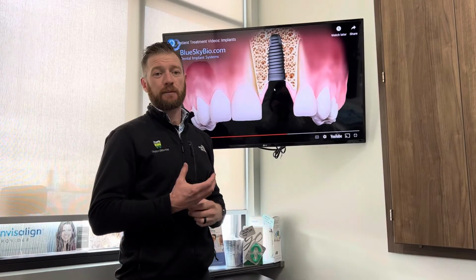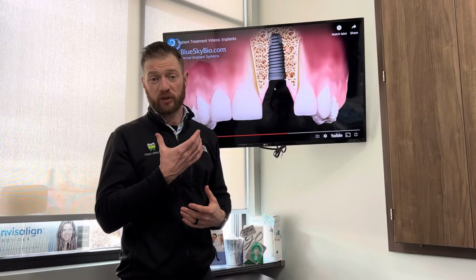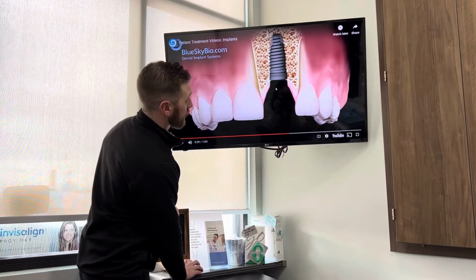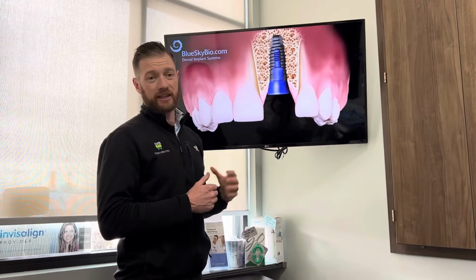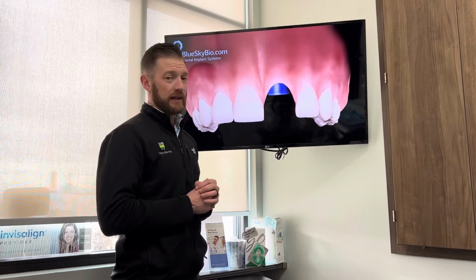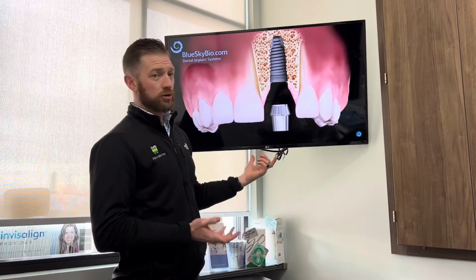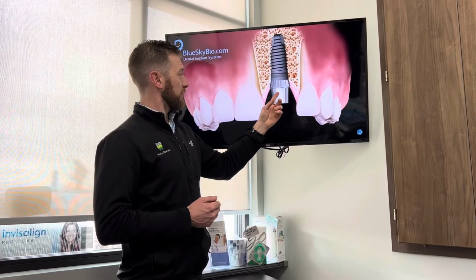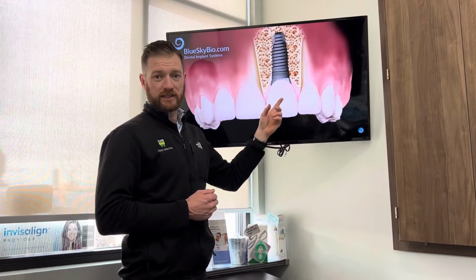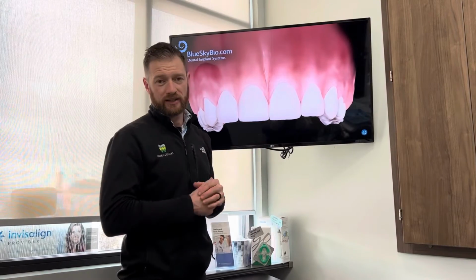We take an impression, or now we scan it with a 3D scanner so you don't have to have that goop in your mouth. And that day, you then leave with what we call a healing abutment. And then it takes about 4 weeks for the lab to get it back from us. You'll end up with a tooth, the abutment and crown. So all in all, that's the abutment, and that's the crown that goes on top. We can either screw that in as one piece or cement the crown onto the abutment.